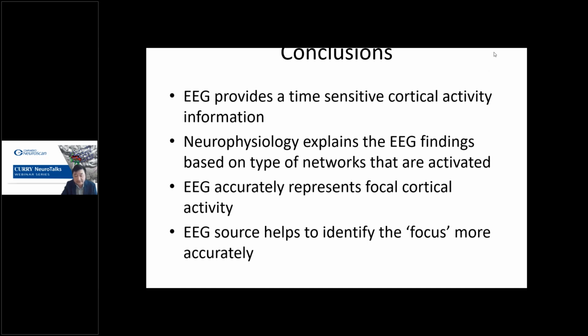Really explains the important value of the EEG in epilepsy diagnosis. Really the time information, the temporal resolution, also the network information that EEG can provide is such a powerful tool.